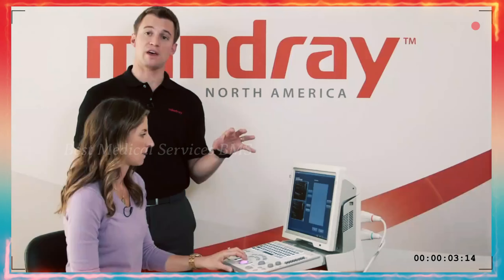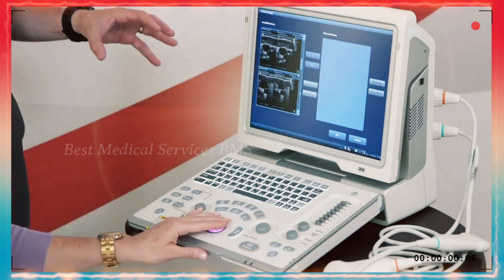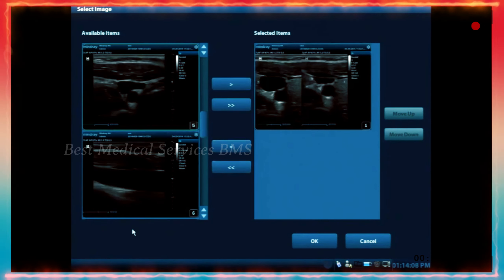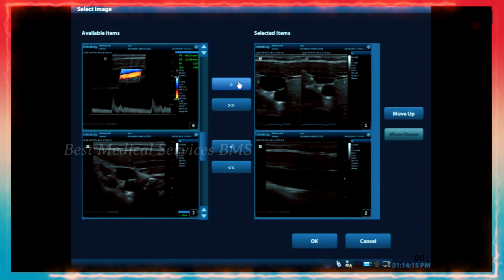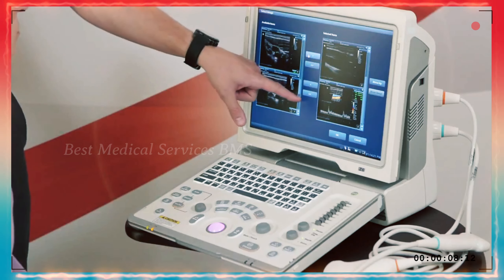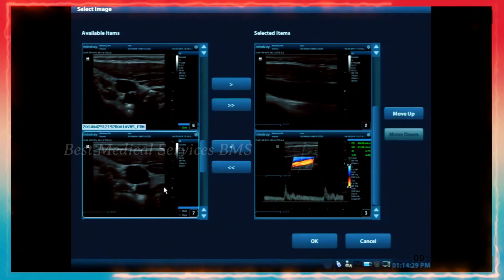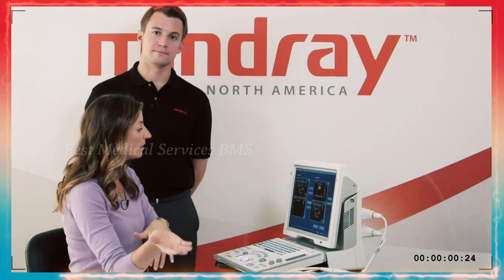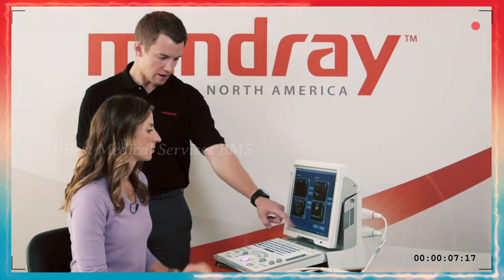You can also change the calculation method from last to average to max, depending on your facility and what type of measurement you're taking. For image select, click on it with the set key — on the left side are all available images. You can move images onto your PDF report using the single arrow to move one at a time, or the double arrow to move all. You can also move them back to available images if you change your mind.